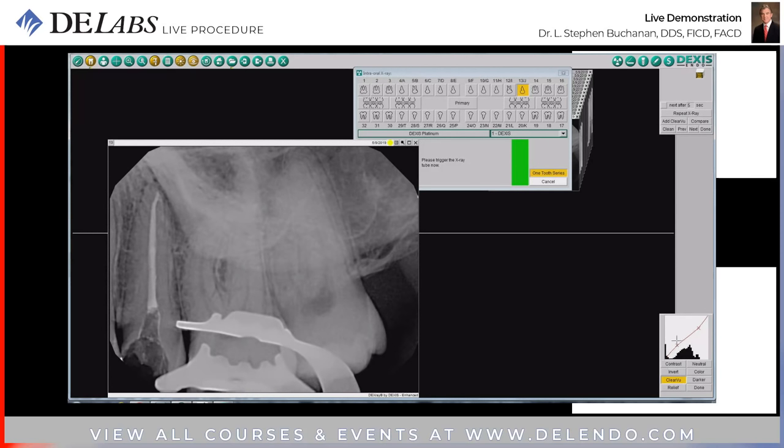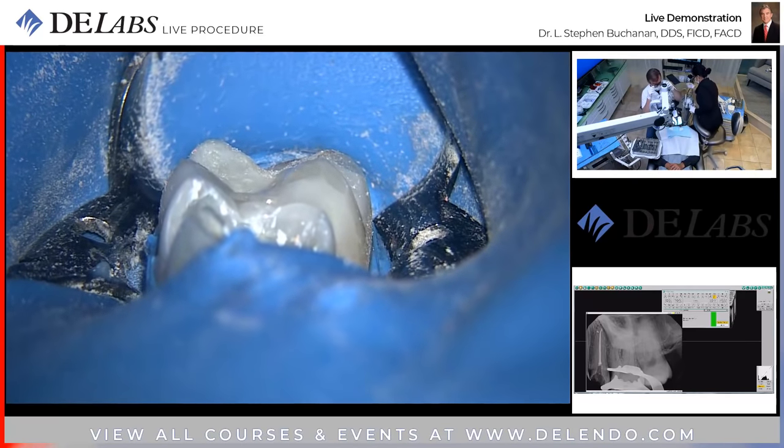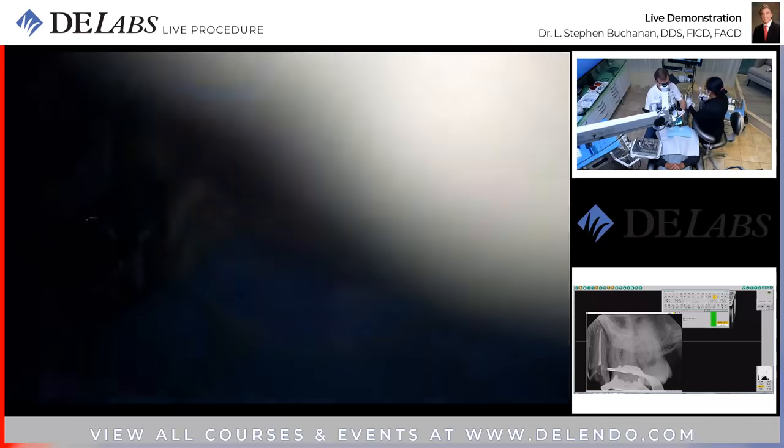Microscopic, can you give me just a little bit more and then we're going to magnify. There you go. And then Lex, look up there. There's a little trail, sealer trail. Can you zoom that? Right there. Okay. Think it's going to work out. Looks pretty nice.